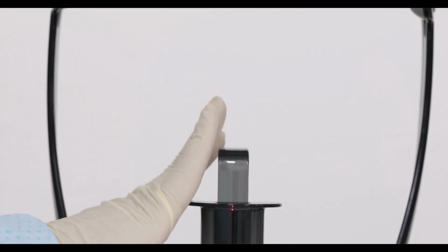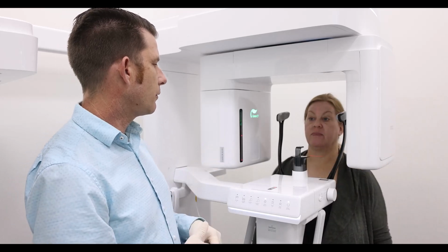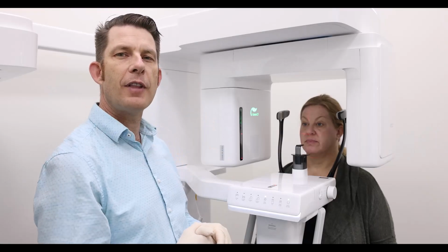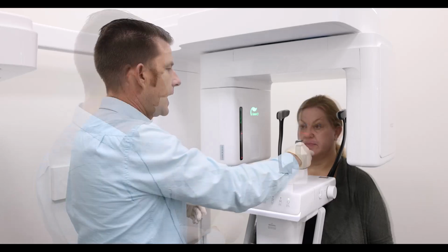We're going to leave the bite stick in for this demonstration. We're going to bring our patient back for CBCT capture. I'm going to go ahead and stand up straight and tall for me. I'm going to go ahead and raise the column up. With CBCT capture, I want the patient with a flat occlusion, the occlusion being parallel to the floor.